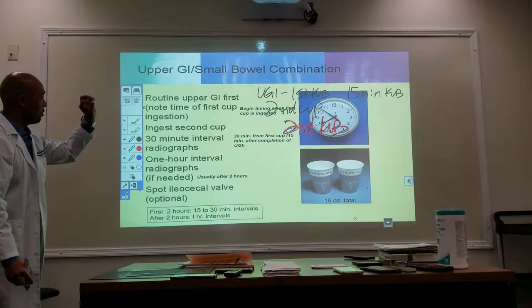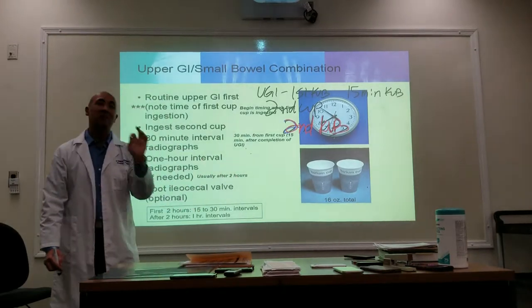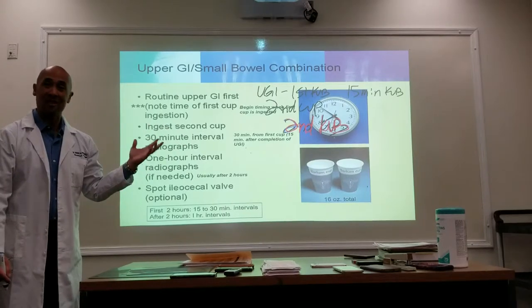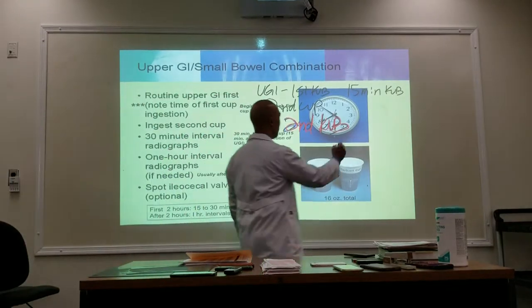After they drank their second cup of barium, you're going to take your second KUB. Remember I said, by the time they're done with that second cup, it's about 15 minutes later. So now, what time would this image be? 30 minutes. This will be your 30-minute KUB.